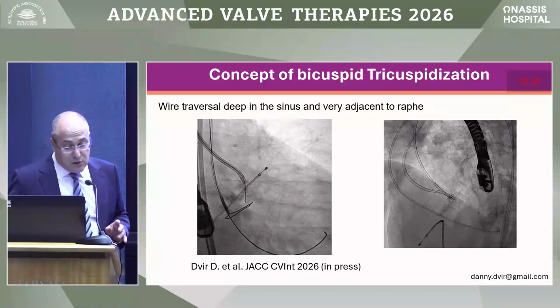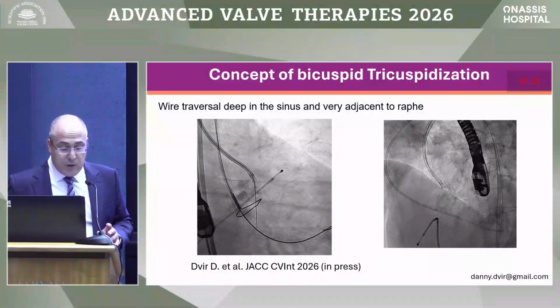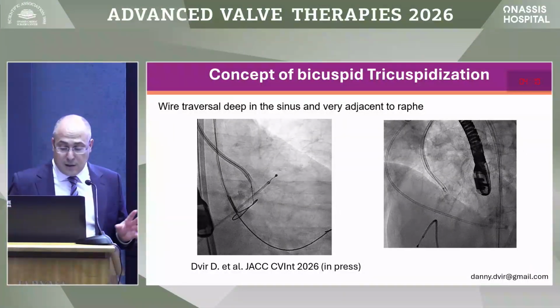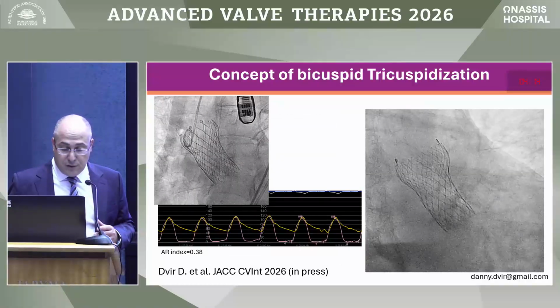This was actually the first patient. You can see the start of a BASILICA procedure. You just need to do it not mid-leaflet, but in a certain location. It's different than BASILICA in that way, and the calcification amount is obviously much different as well.